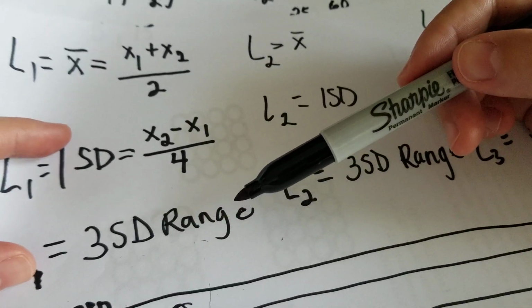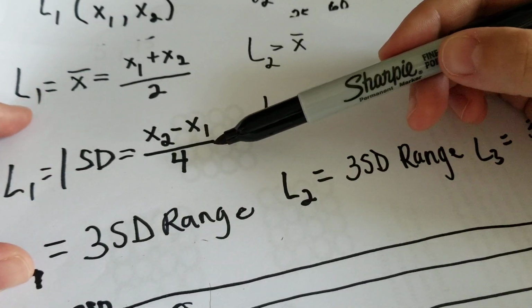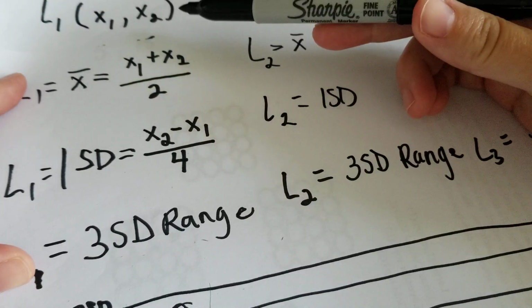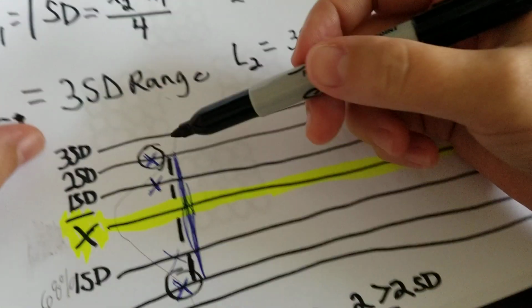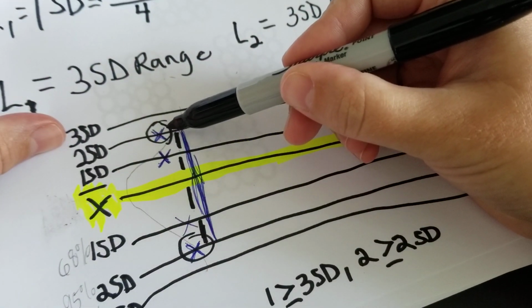Well, again, we want to go with things that we know. So when we identify what the 1 SD is, we're able to then use that with what we already know and figure out that range. What we already know are these 2 numbers, the 2 SD range, right?